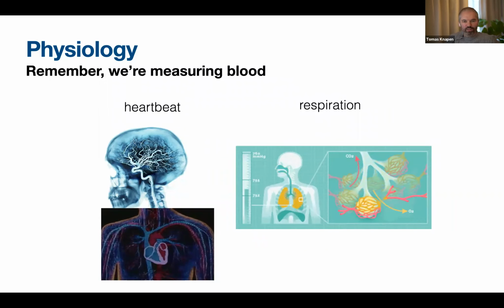You breathe, so that's going to change the oxygen in your brain's blood, right? So that's going to have an effect. And then the respiration is even worse because when you breathe, your whole body more or less changes position, right? So breathing actually has a pretty large effect on where your body is in the scanner. And that changes that B0 magnetic field, and it really changes also the intensity of the images that come out. So breathing actually is bad.